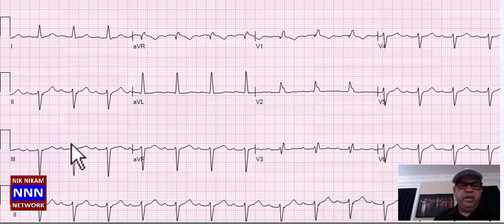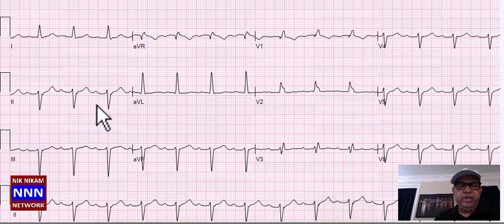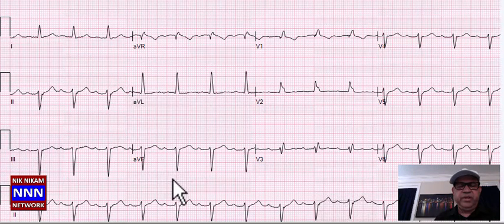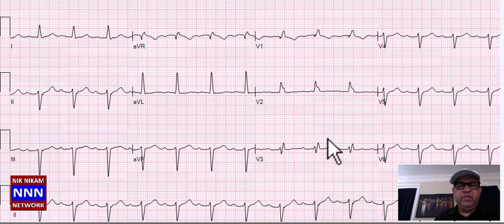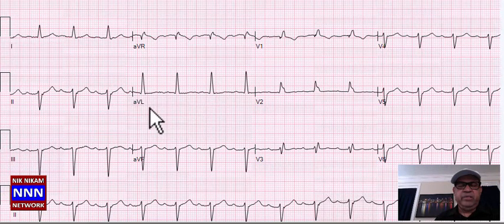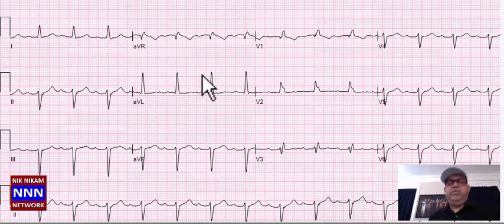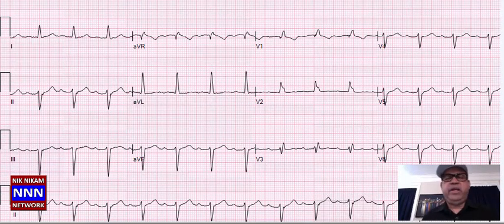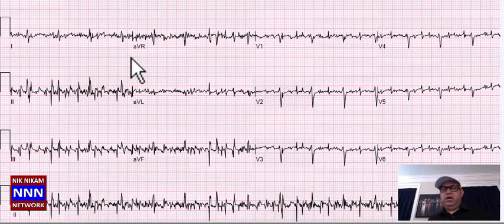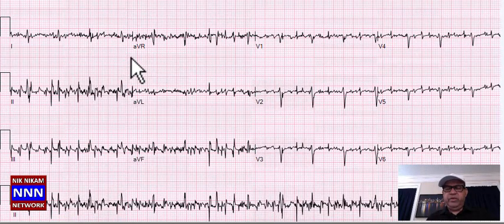Sinus rhythm with left axis deviation — QRS complex more negative than positive. Left axis deviation, left anterior hemiblock, right bundle branch block, non-specific ST-T changes — we are talking about bifascicular block with non-specific ST-T changes.